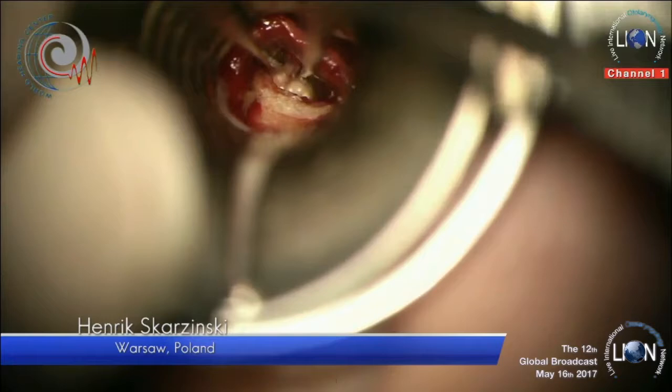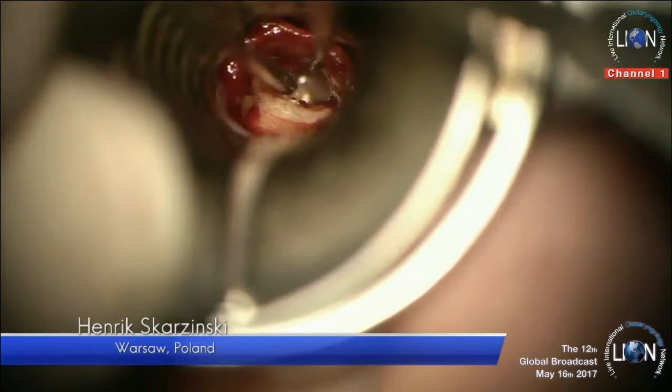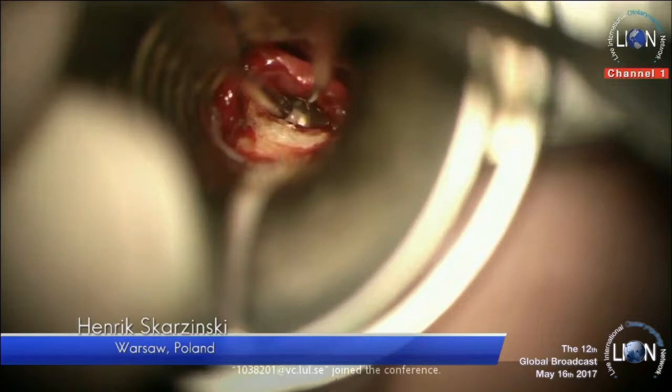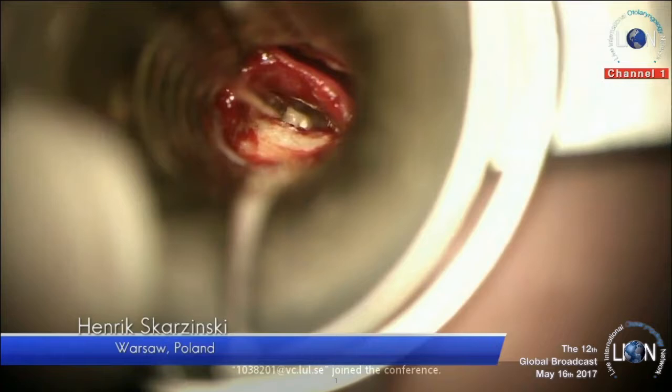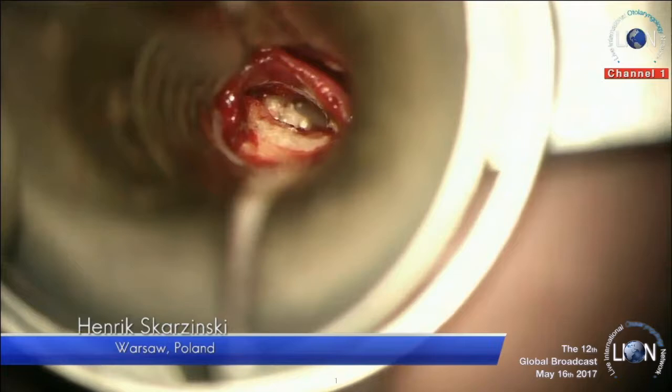You can see now the connectivity between the two bones. It took us around one minute, forty seconds. It's very quick because, as you can see, we stopped the bleeding quite fast. When we have bleeding it's much more problematic. The key point is to really dry the bones before we put the cement. A common mistake we see after surgery is that the whole cement block came out, meaning the bones were not dry enough before the cement was applied.